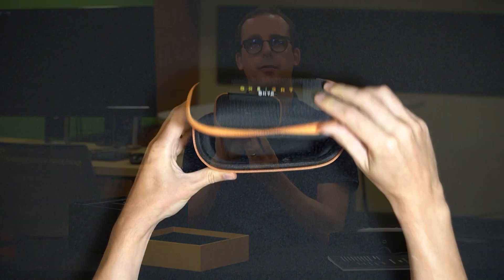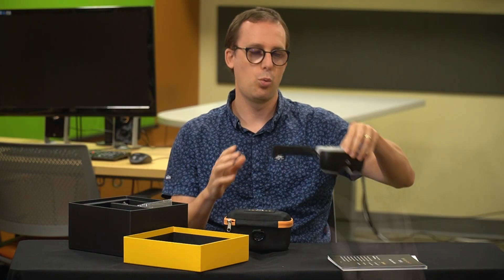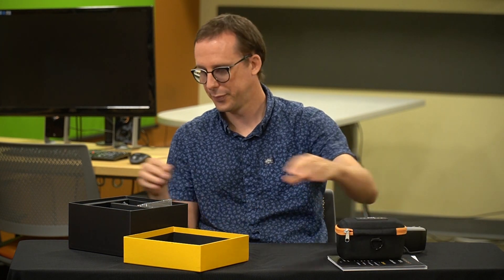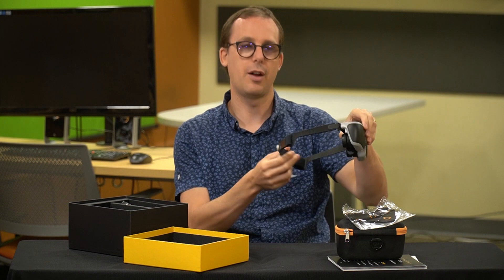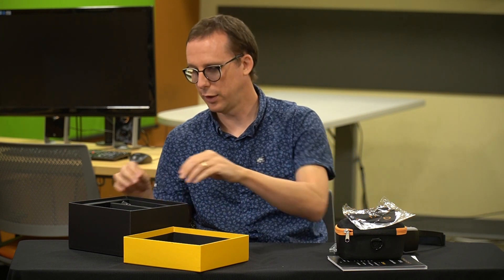Here we have a case for the device so we can transport it. It actually doesn't fit in here with the arms on, so that's the only downside. But the arms are removable, and we'll be taking a look at that in a little bit. Next, we have a cleaning cloth if you need to clean the camera, and then we have a spare strap — this goes around the back of the head, and we have a spare just in case we break the one already on there.